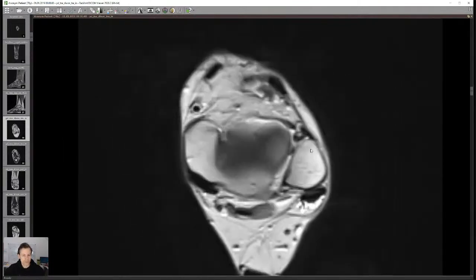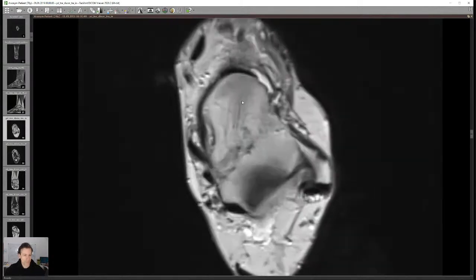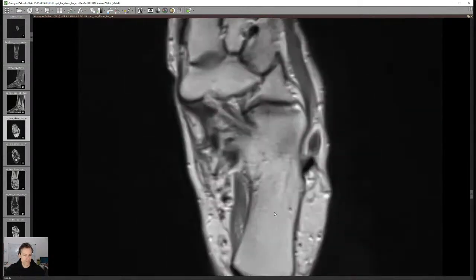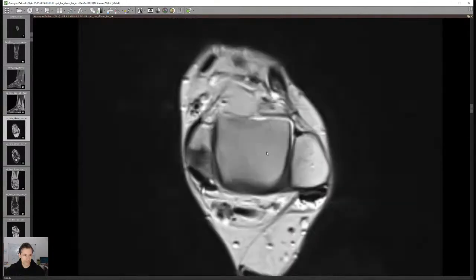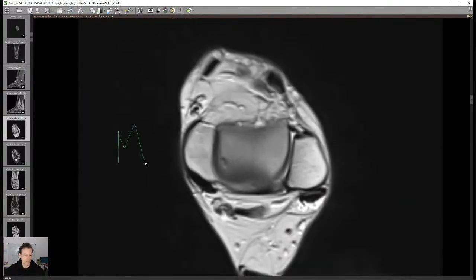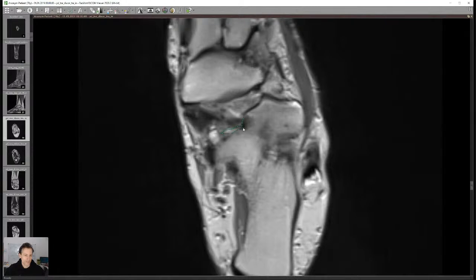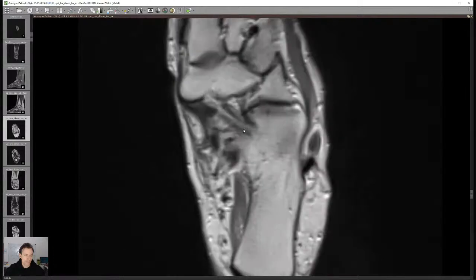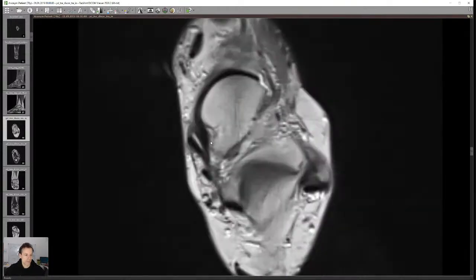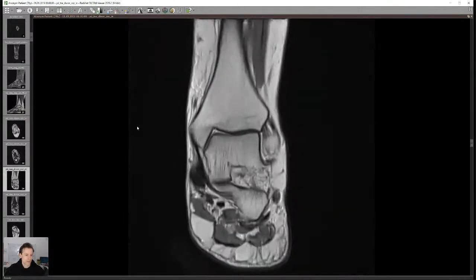There's an easy way to assess the spring ligament. Start on the transverse sections, scroll down to the calcaneus — medial on this side, lateral on that side. At some point the calcaneus makes a 90-degree angle, and from this angle you have two ligaments going in different directions, part of the spring ligament complex. The important one is the supramedial portion, best seen on coronals.